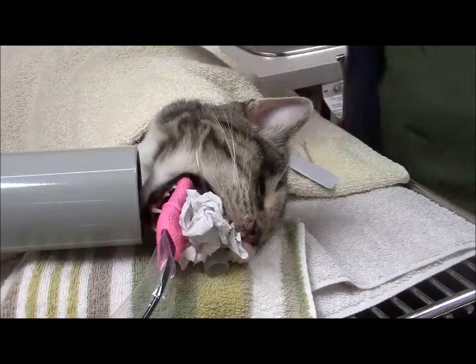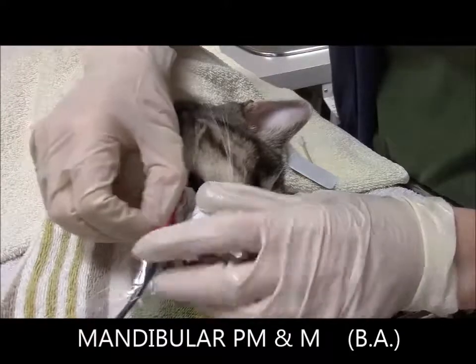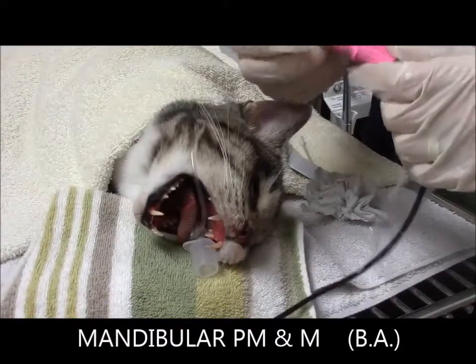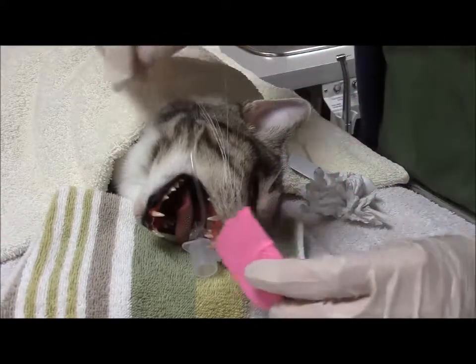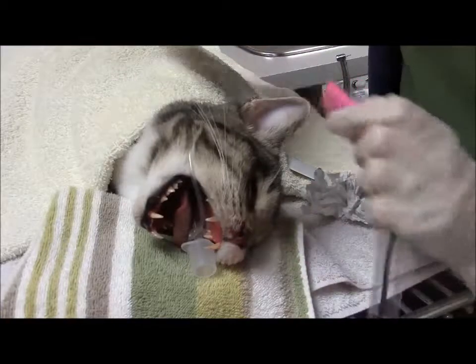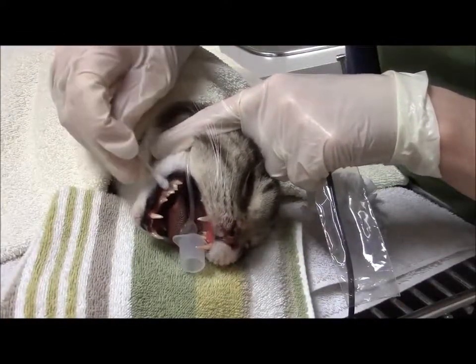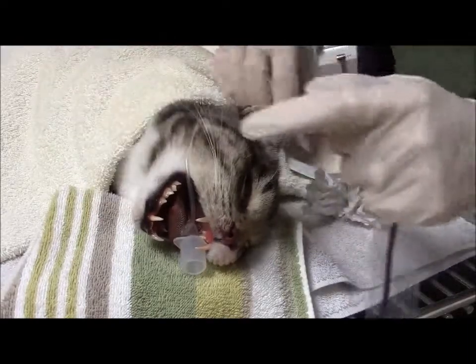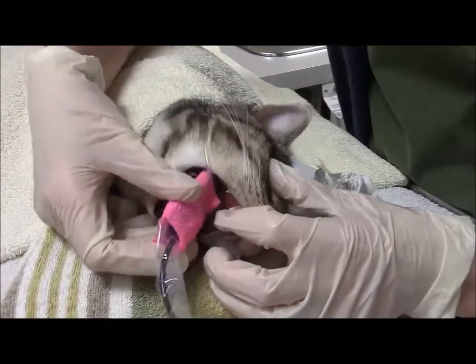So the next one in line that I want to do leaves me just with these mandibular premolars and molars. This is generally an area that I would use parallel technique, because these sensors are bulky, it makes film placement difficult. So with a parallel technique, I'll for sure get the last molar and I'll likely get the fourth premolar, but the third premolar is the tooth that I'm likely going to cut off. So what I recommend is doing a bisecting angle on that area.